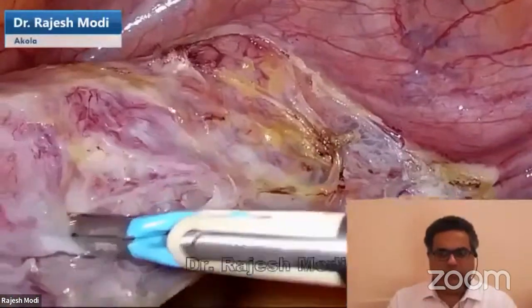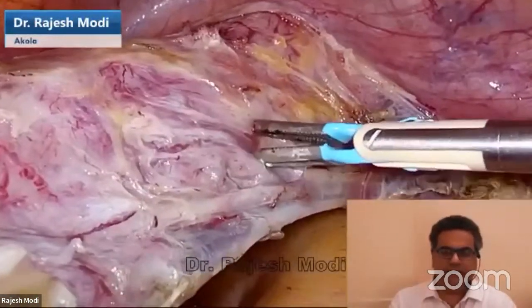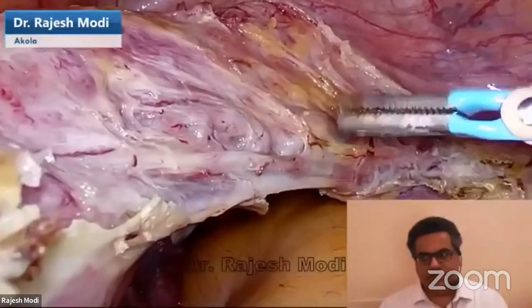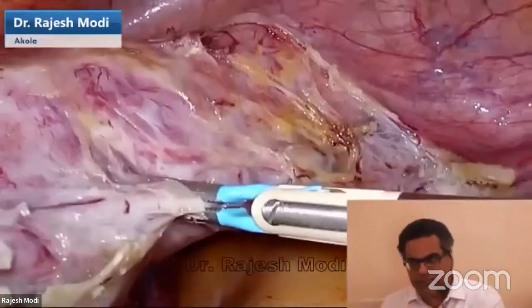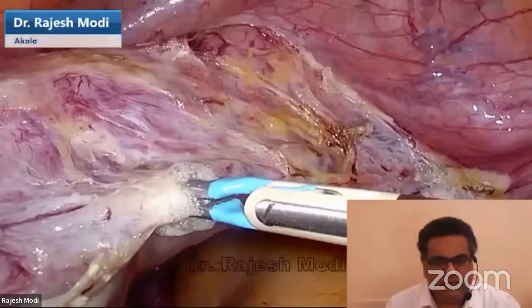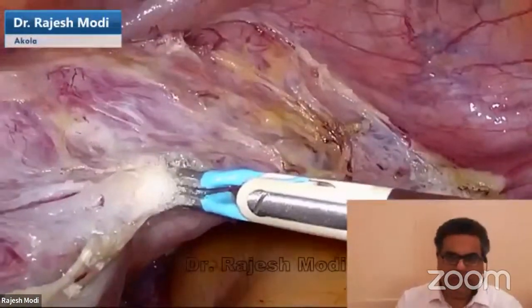I really don't believe that there is a necessity or a need to skeletonize or isolate the ureter by dissection. It's not required in benign gynecology. So unless there is a specific need for lateral pelvic wall dissection or lymph node dissection in this particular area, I really do not like to touch the ureter for dissection purposes. A simple laparoscopic hysterectomy is far away from the ureter.